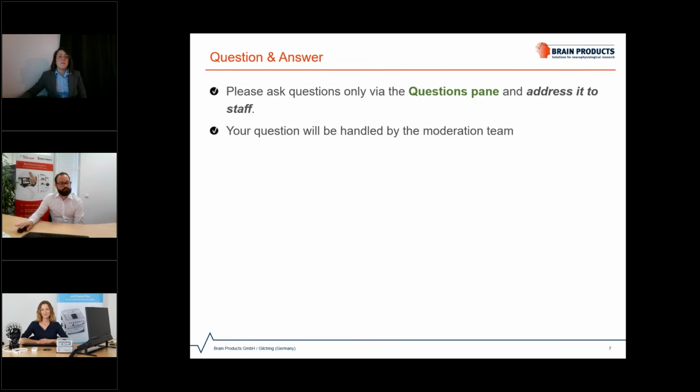Okay. Thank you so much. One more question for you. Which algorithm is used to resample both data sets? That is a very good question, which I luckily checked earlier. It's a cubic spline interpolation. Okay, thank you very much.